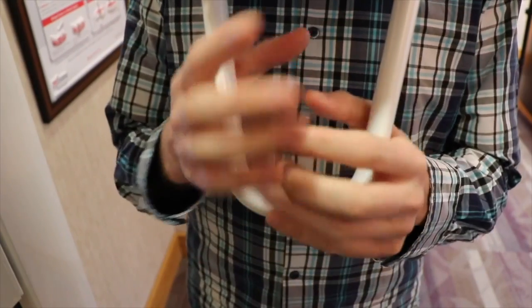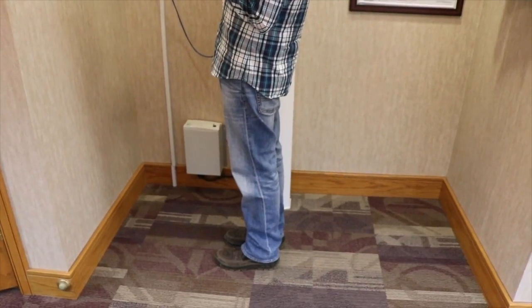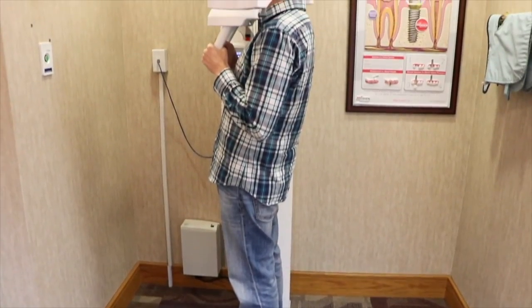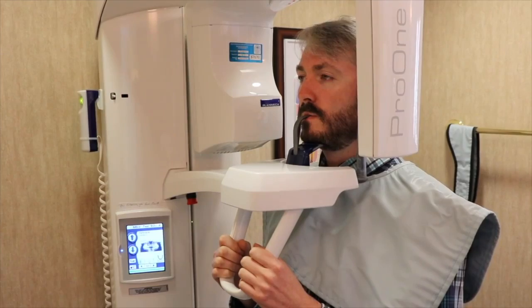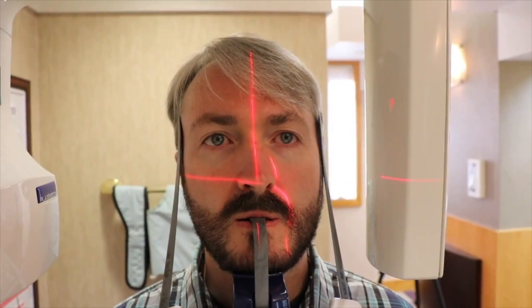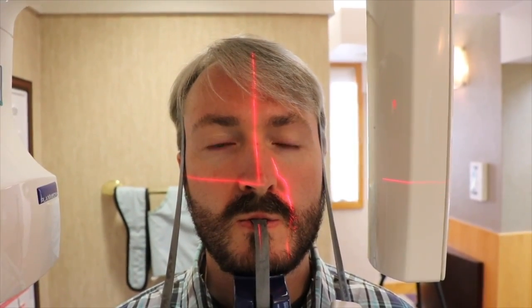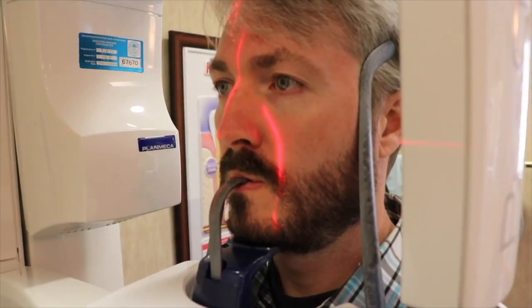Have the patient hold onto the machine. I will tell them I need their hands and will gently grab their wrists to lead them to the handhold. Next, I place my foot in front of their shoe and I say, move your feet forward until you hit my shoe. They should feel and look slightly off balance after they've completed this movement. For our machine, I tell the patient that I have two little plastic pieces that are going to hold them straight for me. Check your alignment. His head was still too high, so I dropped him down some more.